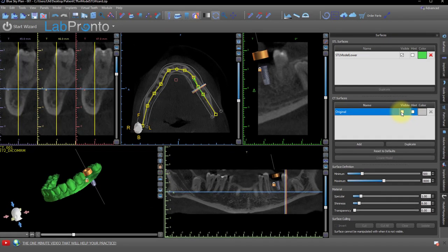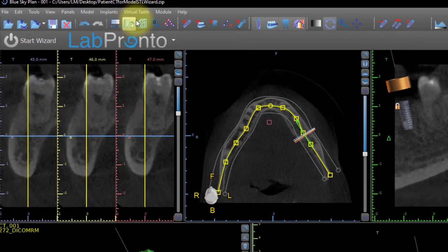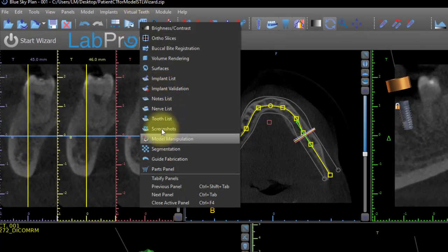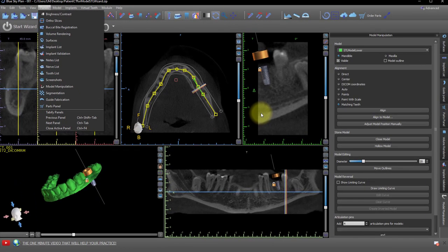Open up the Model Manipulation panel. If you don't have it open, you can go to the panel's toolbar and select Model Manipulation, or go to the panel's menu and click on Model Manipulation.